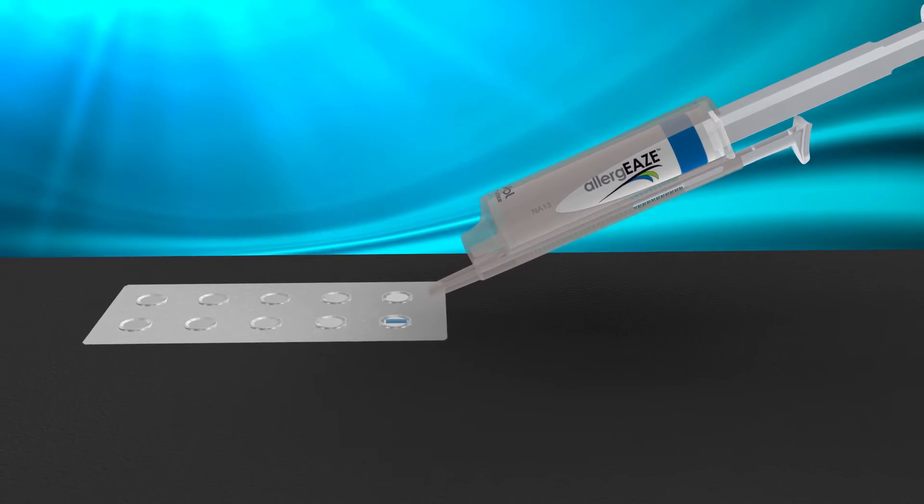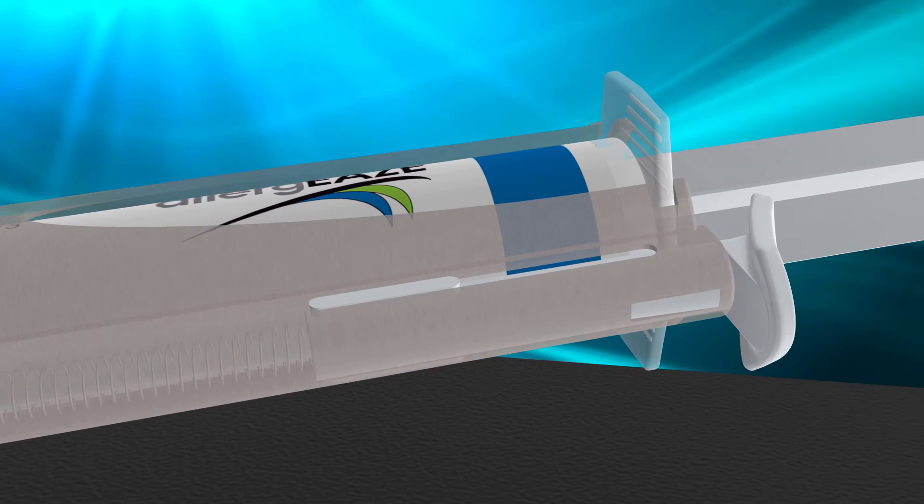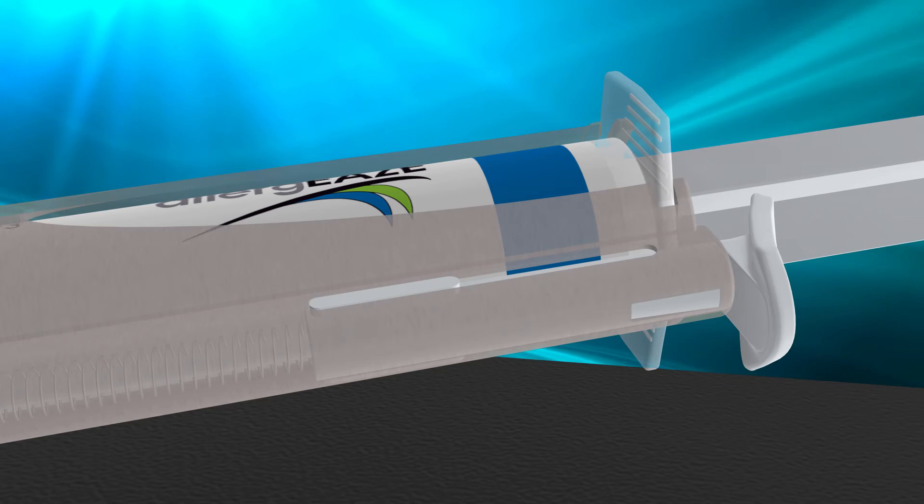It's that easy. When you're finished, place the Truvol plunger in the locked position. This closes the system and helps prevent oxidation of allergens.